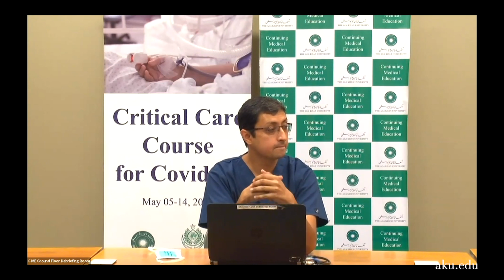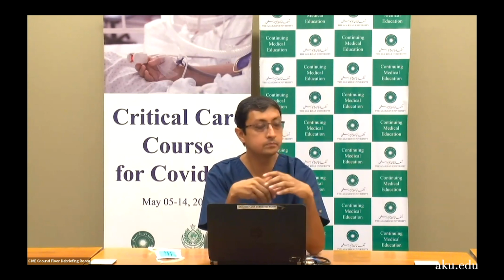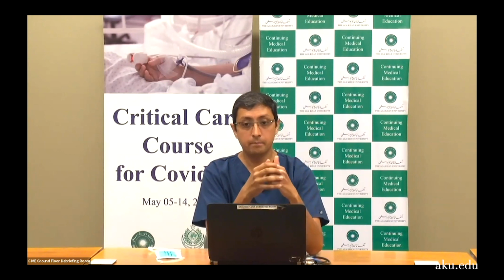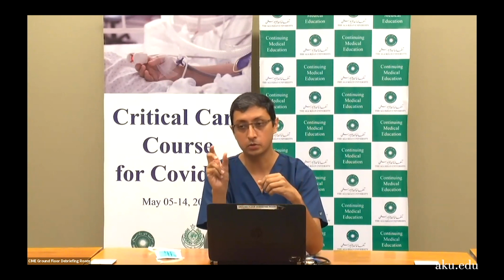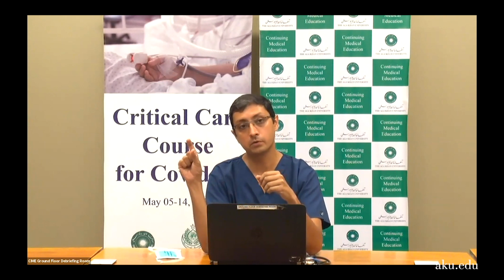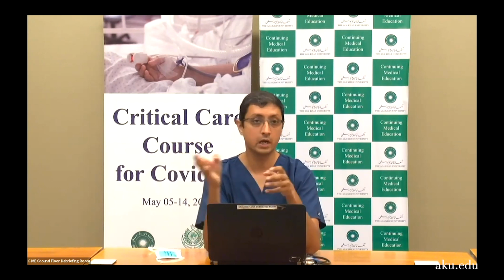The other question is: when in pressure controlled ventilation, if the patient doesn't reach the trigger, is the pressure not delivered to the patient? In pressure controlled ventilation, it's a mandatory mode. It's controlled. If a patient does not trigger, then whatever you have set for the control mode will be delivered to the patient. If a patient triggers, then whatever pressure you have set for the trigger mode, for the spontaneous mode or pressure support mode, that will be delivered to the patient.